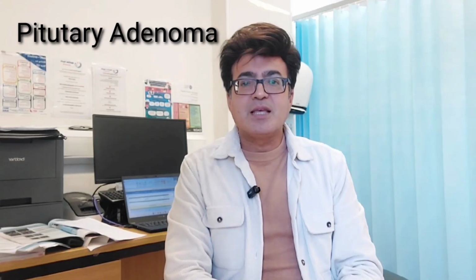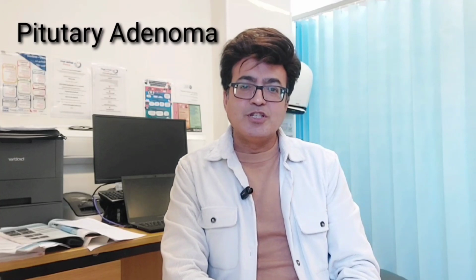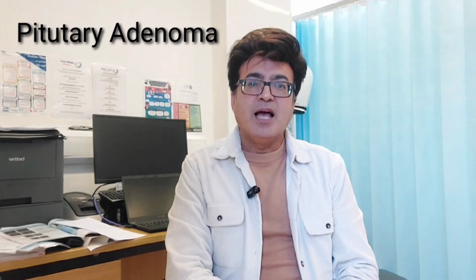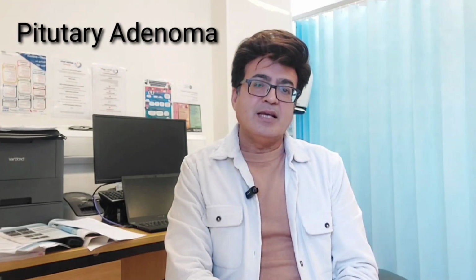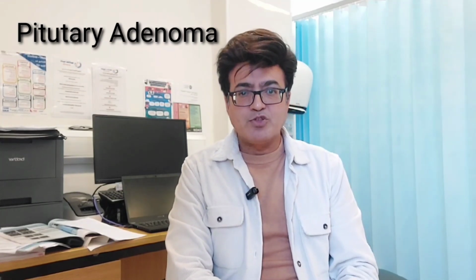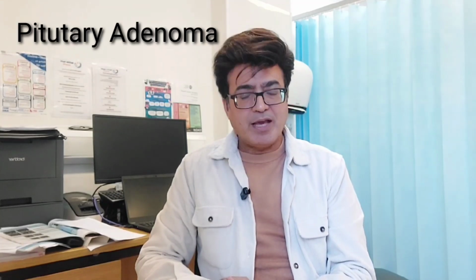Today I'm going to discuss one of the very important brain tumors, that is pituitary. I would rather say it's a pituitary tumor. So this is called a pituitary adenoma. Pituitary adenoma is a slow growing tumor and it arises from the anterior pituitary, and it is of two types. It may be microadenoma or it may be macroadenoma. Microadenoma, if it happens to be less than 1 centimeter, and if it increases beyond 1 centimeter, it will be called or considered as macroadenoma.